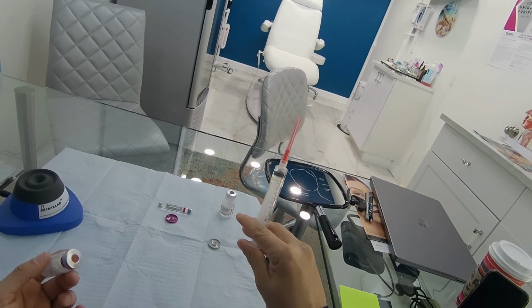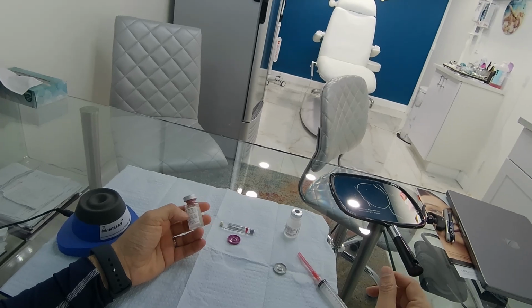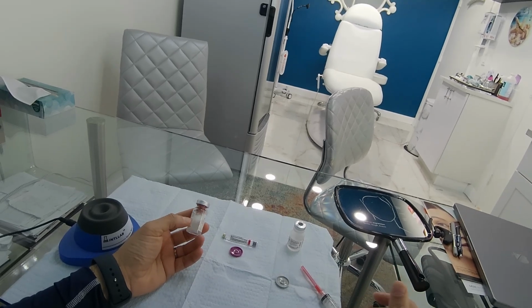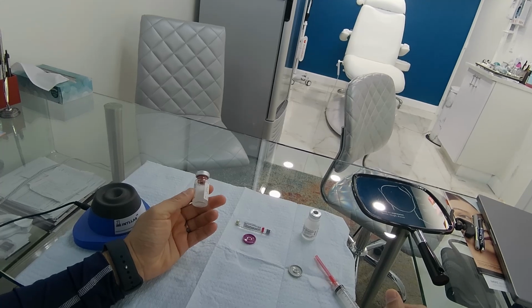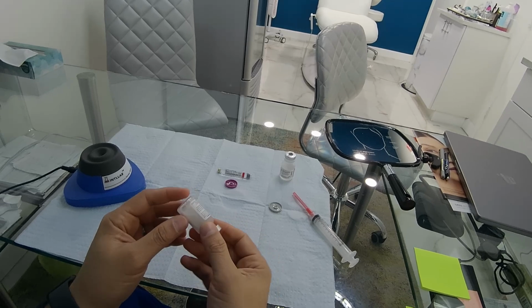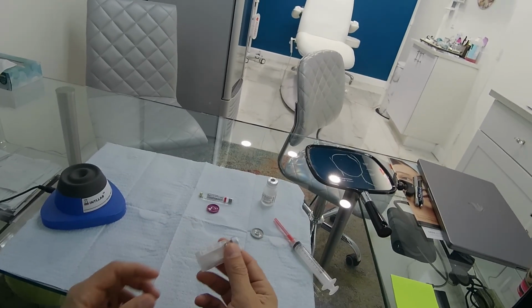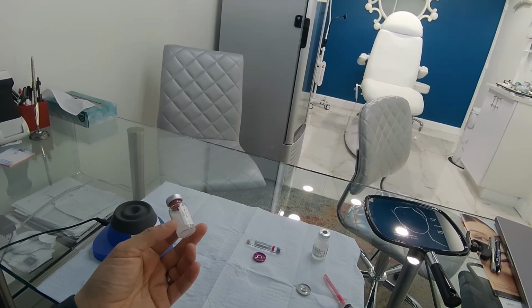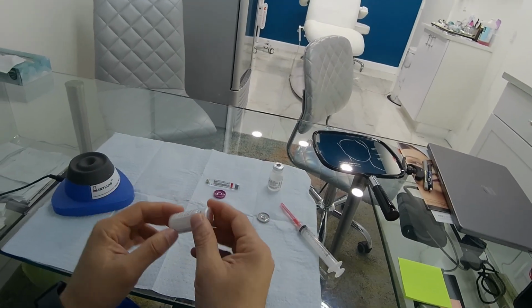So it's good to mention here that the recommendation in the past was to mix it like 3 to 4 days before the injection, and then the newer recommendation is to mix it like 24 hours before or so, so that all the particles dissolve. You see how it's clumps here, so basically we need all that clump to dissolve. And the new recommendation actually is just to really mix it, and you can use it even half an hour or 1 hour before you inject it, if you really mix it and make sure it doesn't have any clumps, and you mix everything.